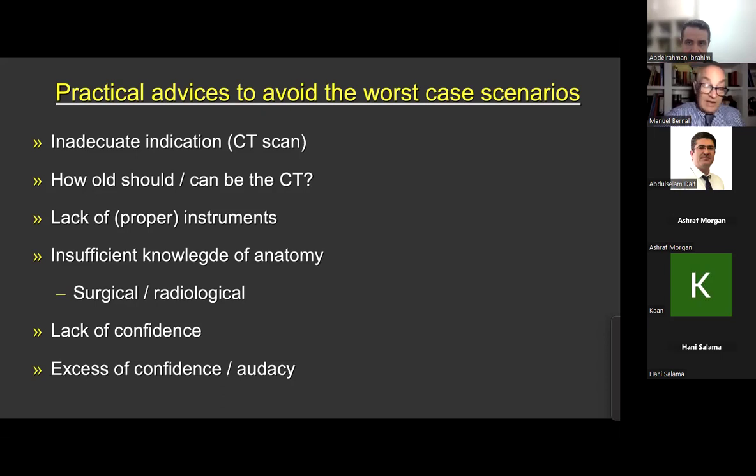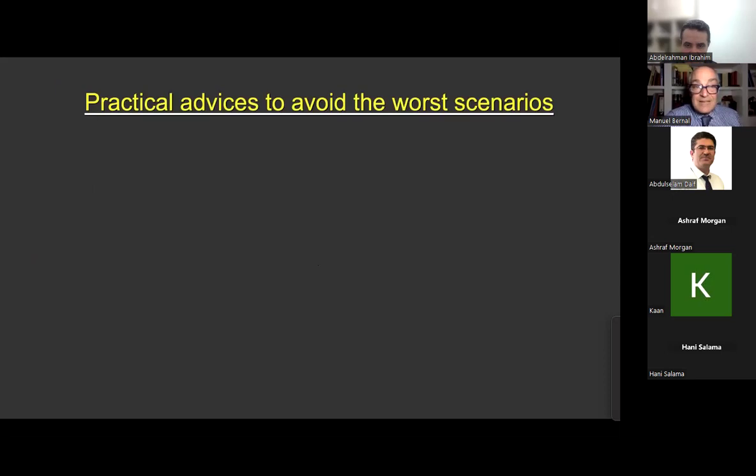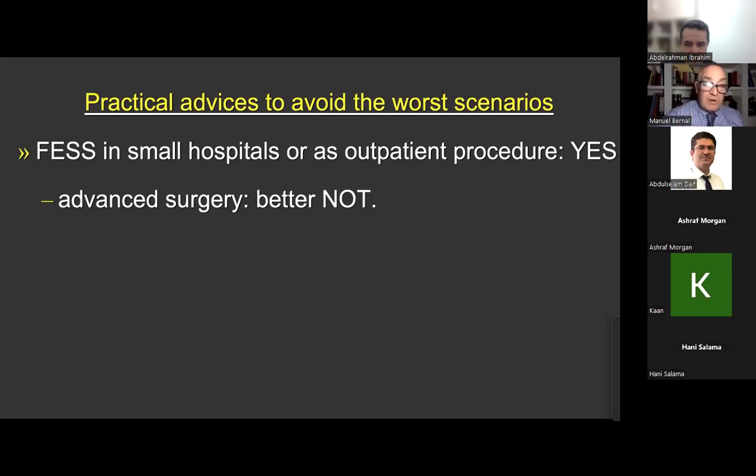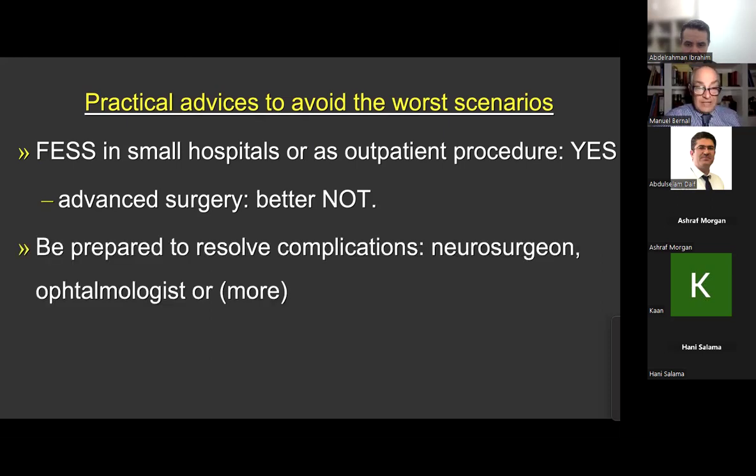But as we know, and I mentioned that initially also, the excess of confidence can lead you into a worst case scenario. Some practical advice to avoid these worst scenarios: whenever you have to perform FESS in a small hospital or as an outpatient procedure, you can do that, particularly if it's a primary FESS. But if you're going to do advanced surgery, an important skull-base revision, because the polyps are very extended, there is osteogenesis, and you need even to drill this area, you better make sure that there is an expert close to you. Otherwise, I would not recommend to do that surgery.